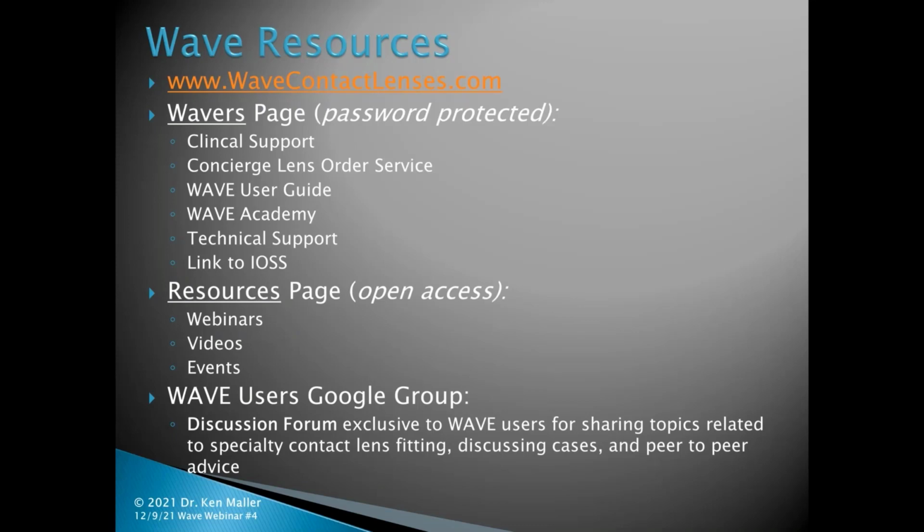Like I said, you really want to pay very close attention to how much data you're actually capturing and which areas are extrapolated, because that needs to guide your decision-making process as you move forward into designing the lens. If you don't have a lot of data out in the periphery, you want to start with the simplest approach first and then see what's wrong with that first lens on the eye so you can troubleshoot it from the slit lamp.